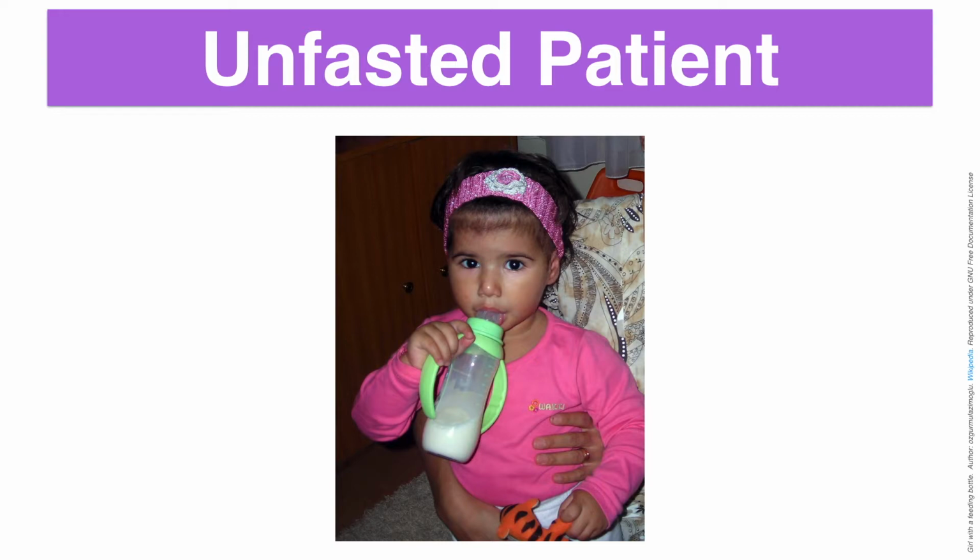You then apply cricoid pressure and give the patient a pre-calculated dose of an induction agent, followed immediately by a fast-acting muscle relaxant. During the apnoea period, while you're waiting for the muscle relaxant to take effect, the patient isn't given any face mask ventilation, so they're apnoeic.